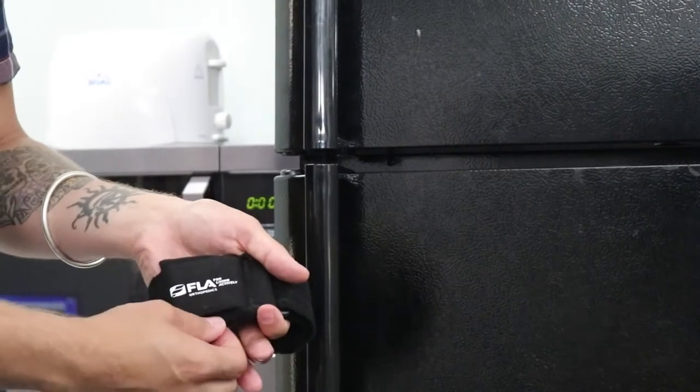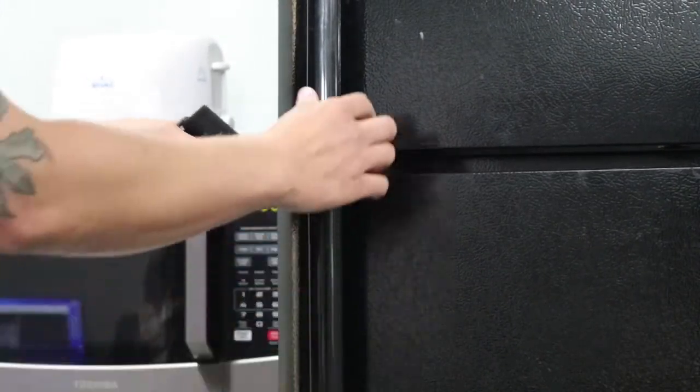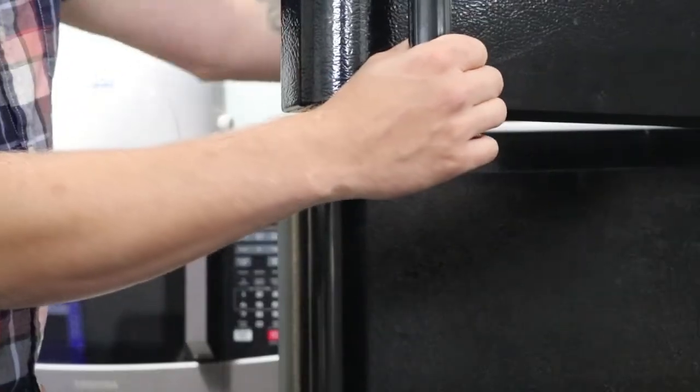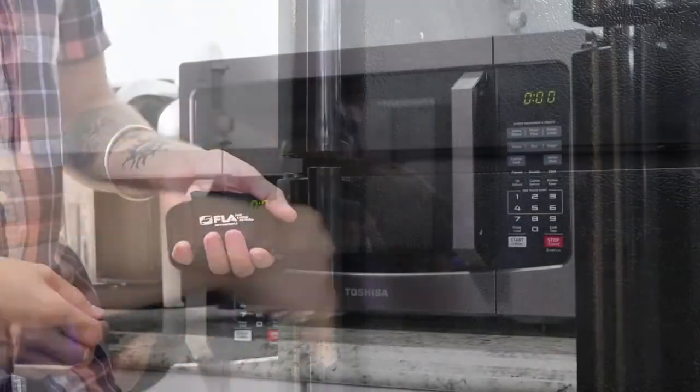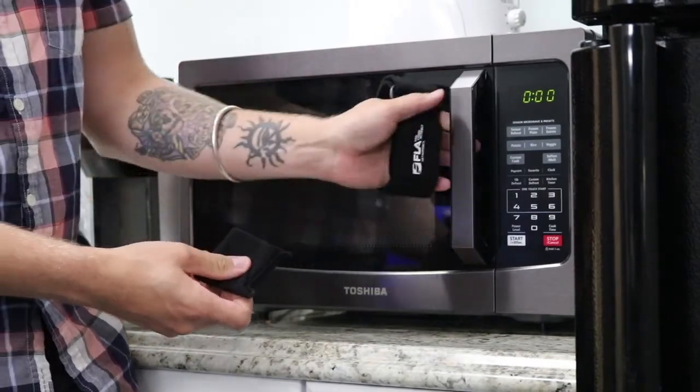This particular armband has a removable gel pack that can be placed in the freezer for at least one hour to provide cold therapy. You may also remove the gel pack and put it in the microwave to provide hot therapy.